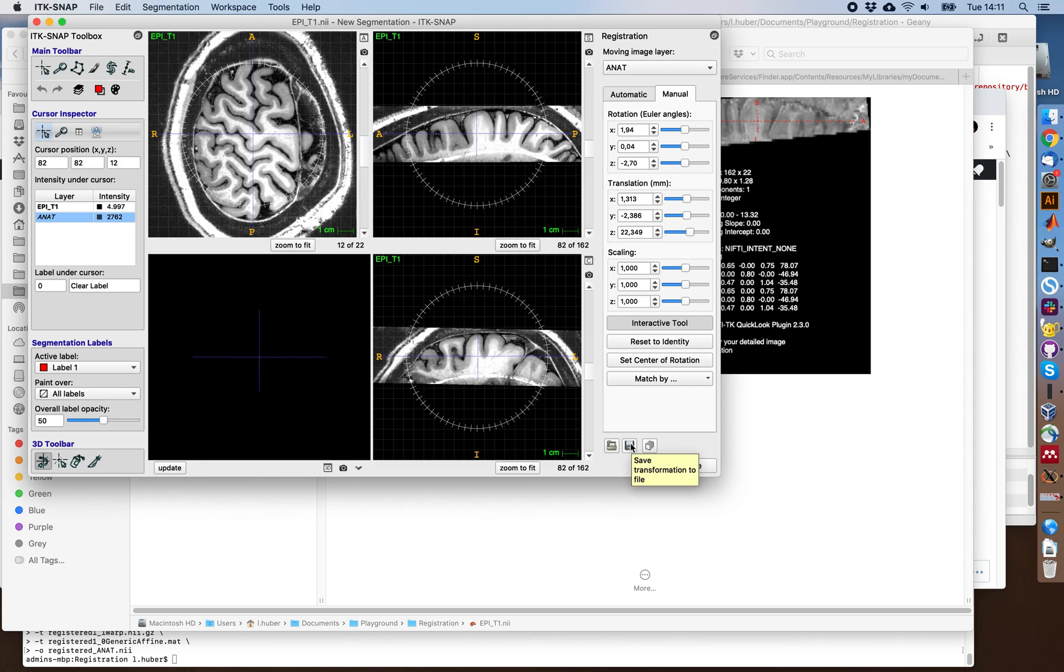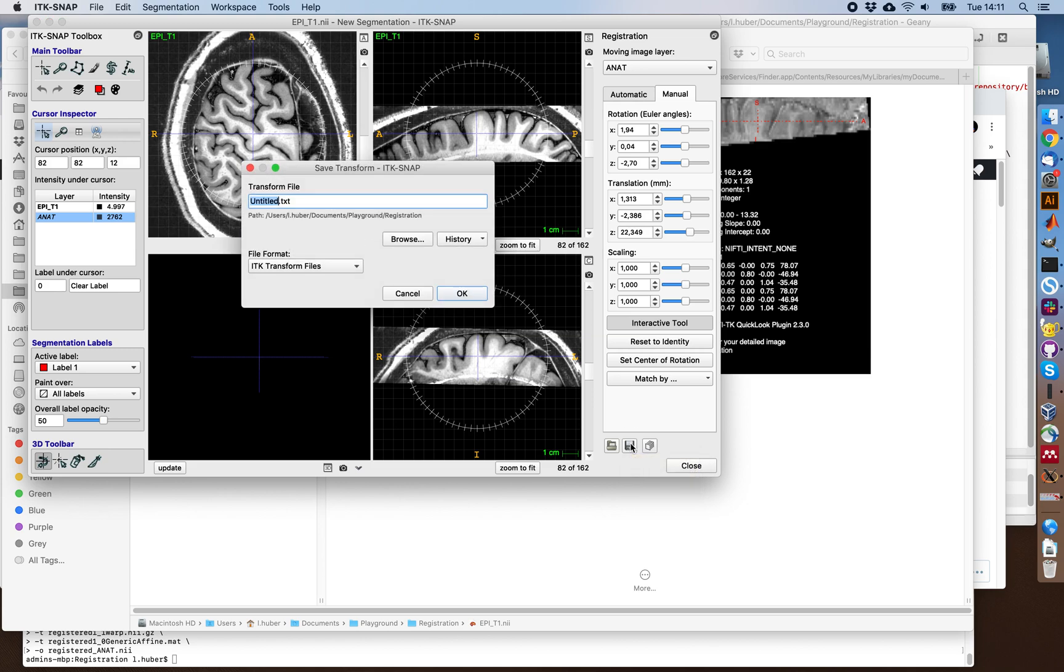And this kind of geometric operation that we just did manually can be saved as a matrix. For example, let's call this the initial matrix and save that.